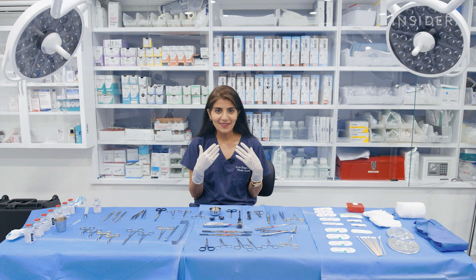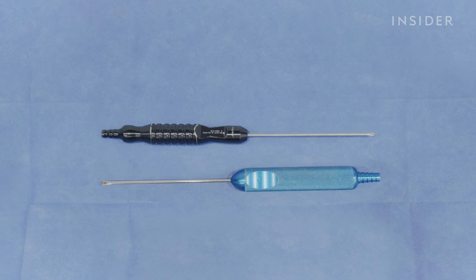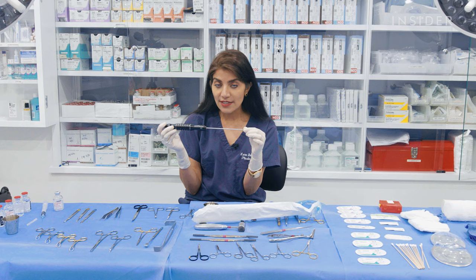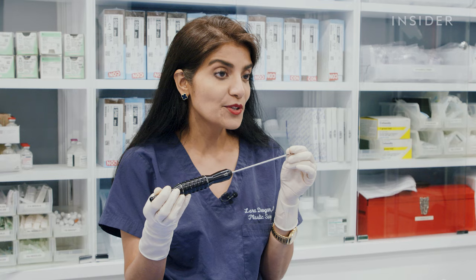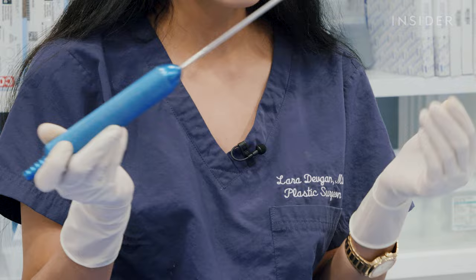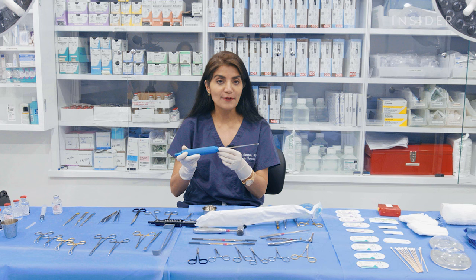Liposuction is a very hot topic, and I wanted to show you some liposuction cannulae. So this is a spatula-tipped cannula, and this is basically a stainless steel surgical straw used to suction fat out of the human body. These cannulae are used specifically for the submental region, so the double chin accumulation of fat. But liposuction can be performed in any area of the body. There are many different cannulas that are available. And I use liposuction cannulae that have a variety of lengths, calibers or thicknesses, and sizes.